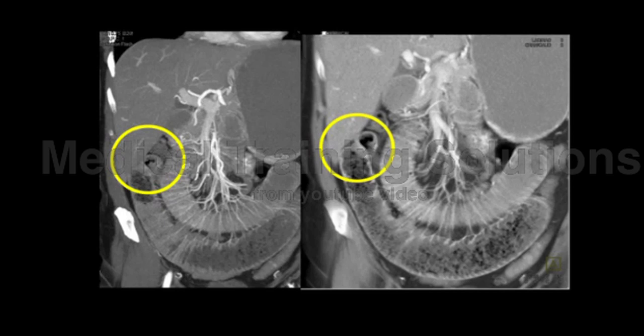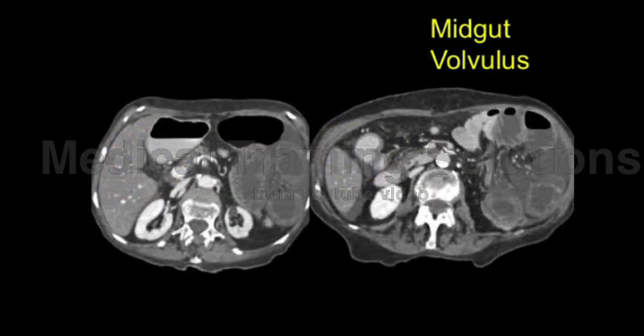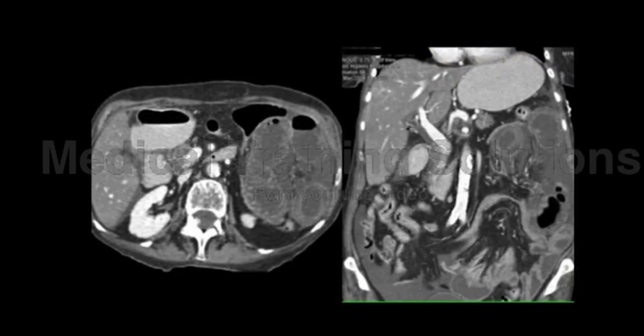Now, one thing we mentioned was the feces sign. The other thing we mentioned was enhancement as a good sign. So look at the bowel in this case. You see dilated bowel loops in the left upper quadrant. They're dilated, they're thickened, but you also notice they're really not enhancing. And we have a good contrast bolus. And that's why we speak so much about the contrast. You also notice there's too much bowel on the left side of the abdomen. Just look at the images.